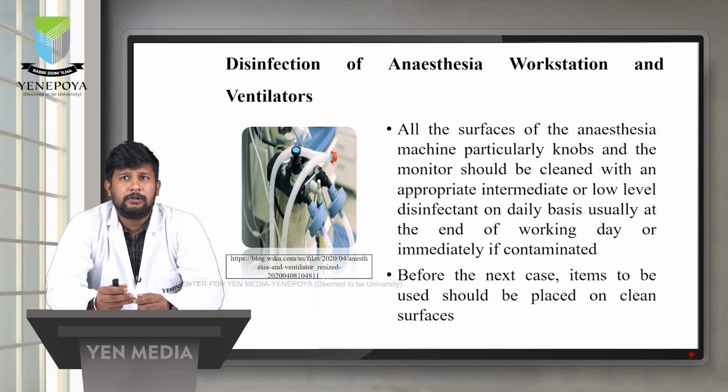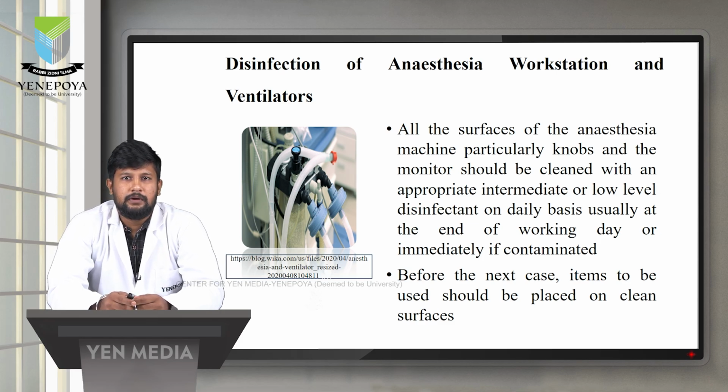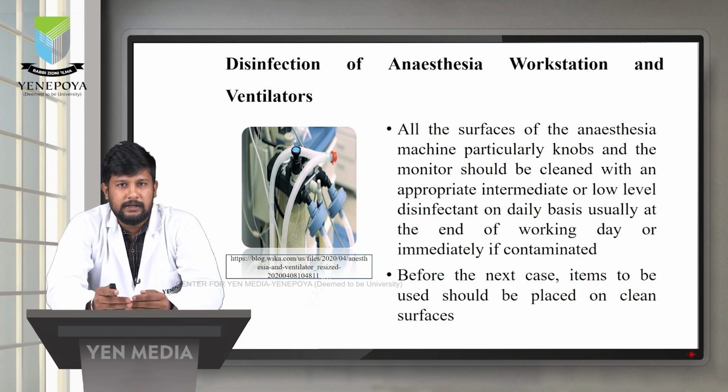All the surfaces of the anesthesia machine, particularly knobs and the monitor, should be cleaned with an appropriate intermediate or low level disinfectant on daily basis, usually at the end of working day or immediately if contaminated. Before the next case, items should be placed on a clean surface.